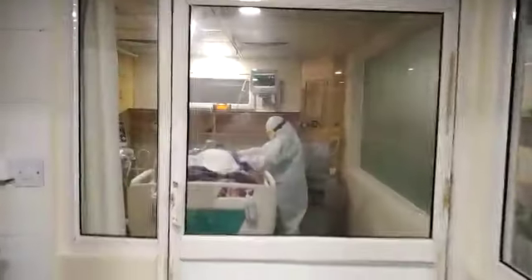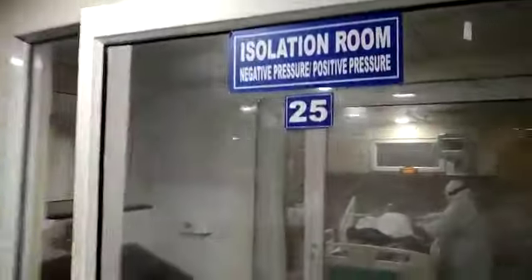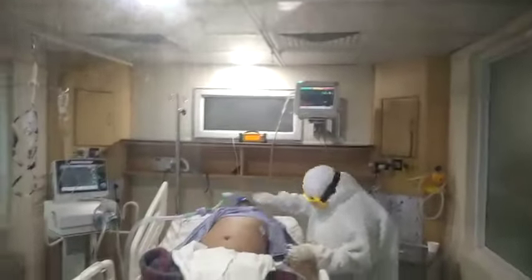This is our X-ray technician and this is our X-ray machine. So this is isolation room as you can see. बाहर से start करते हैं. This is isolation room and this patient is highly COVID suspect. एंड इसको हमने अभी इंट्यूबेट किया हुआ है. बाहर से ही दिखा देता हूँ मैं आपको.